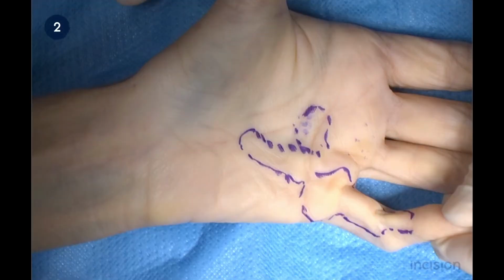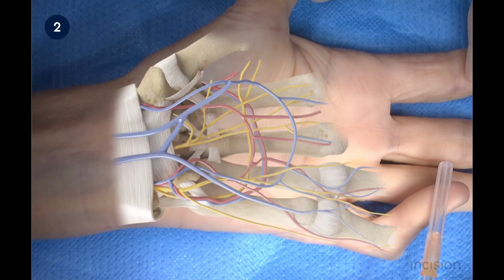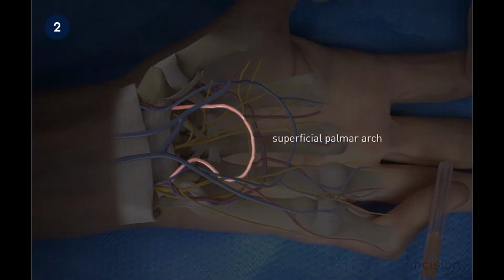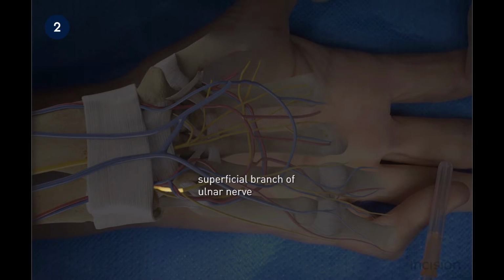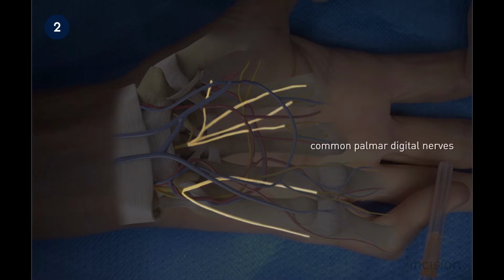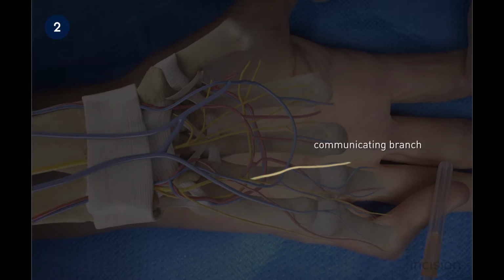Before starting the aponeurotomy, the location of the nerves and arteries should be considered. For educational purposes, the marking is removed and the most important arteries and nerves are now shown using an anatomical inlay. Note the superficial palmar arch, the median nerve, the superficial branch of the ulnar nerve, the common palmar digital nerves, the proper palmar digital neurovascular bundles, which run alongside the flexor tendons, and the communicating branch of the median nerve with the ulnar nerve.